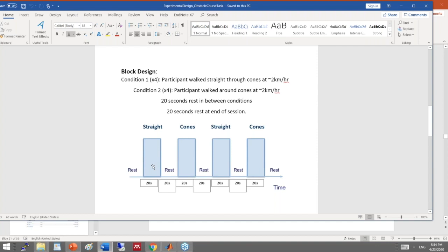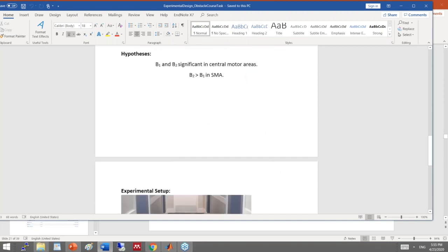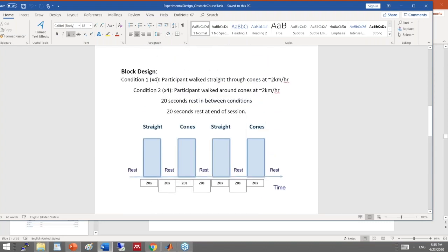In condition one, participants walk straight through cones at two kilometers per hour. In condition two, participants walk around cones. It is expected that the second condition would result in higher activation than the first. Looking at HRF, we expect higher activation in the second condition — that is the key takeaway.